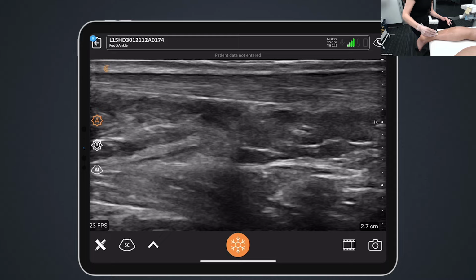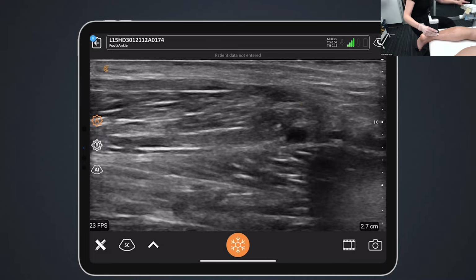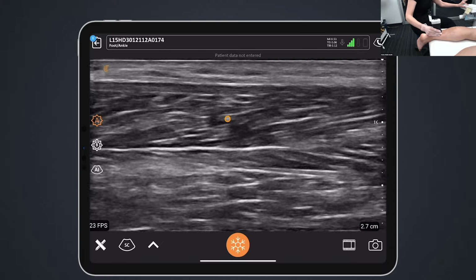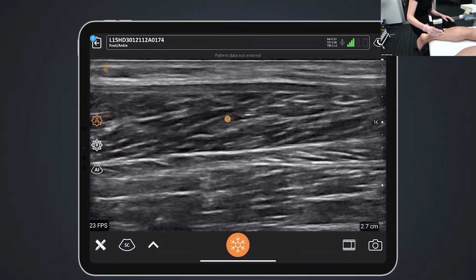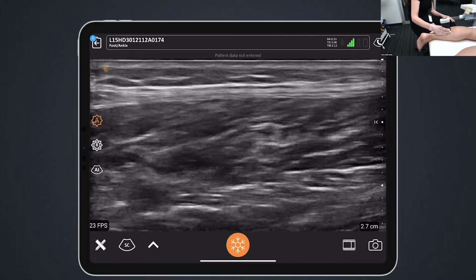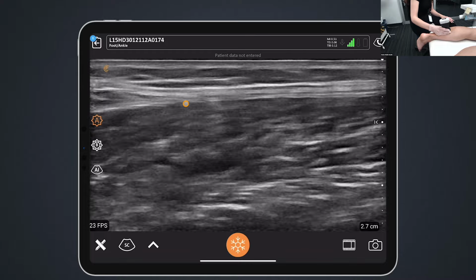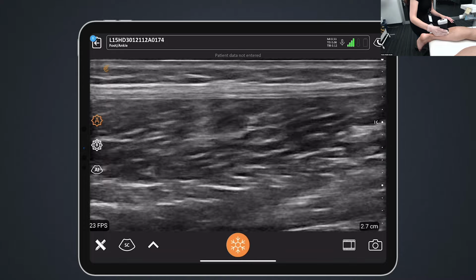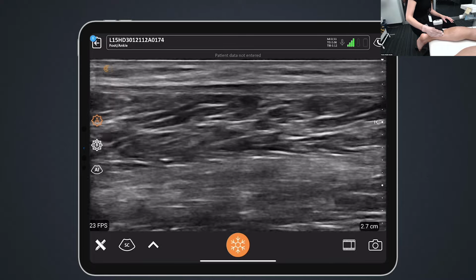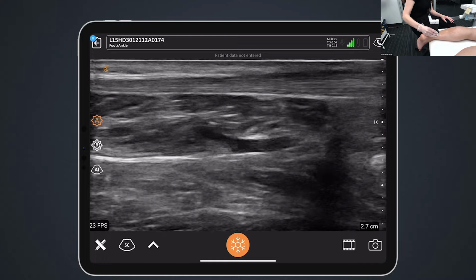The tendon starts to thin as we move up towards the calf, and we can see the soleus muscle come into view here just deep to the tendon. And as we move up, the tendon really thins out as it extends into the soleus muscle and also the gastrocnemius muscles, medially and laterally. So we can see it nice and thin. There's the gastrocnemius right here. And we'll come back down in sagittal, looking for those nice parallel fibers. We don't want to see any bulging out of the tendon, indicating pathology. You can see it nicely right here.